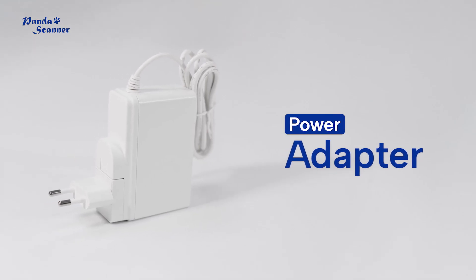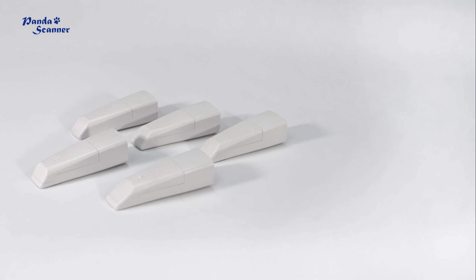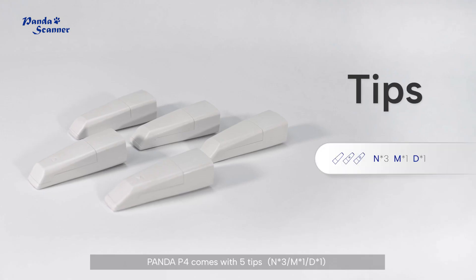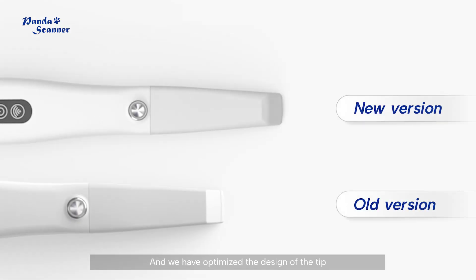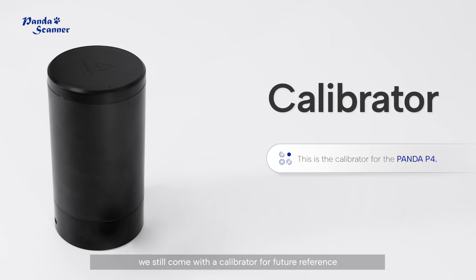This is the power adapter; the plug is detachable and can be replaced. Panda P4 comes with five tips, and we have optimized the design of the tip.